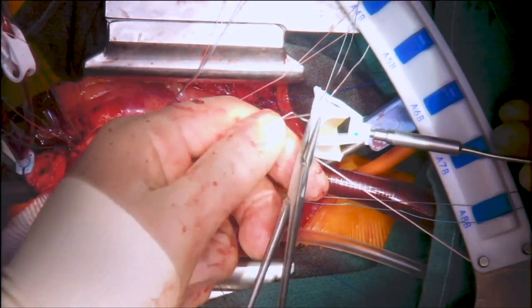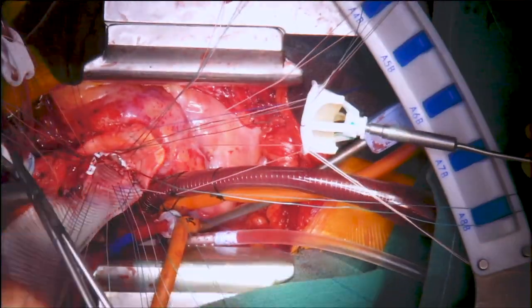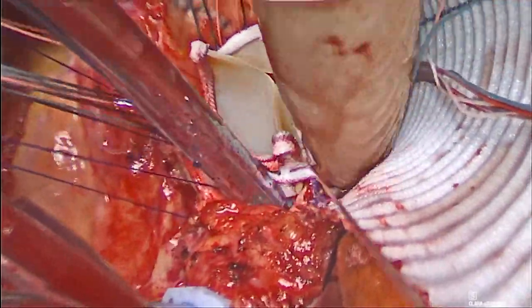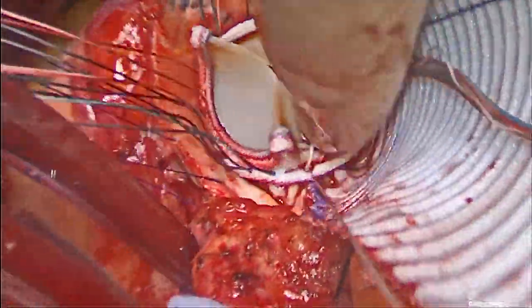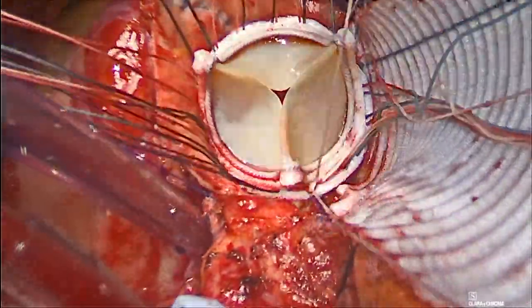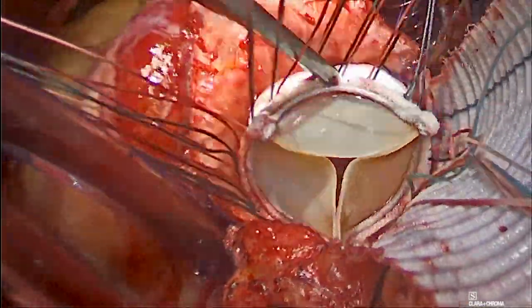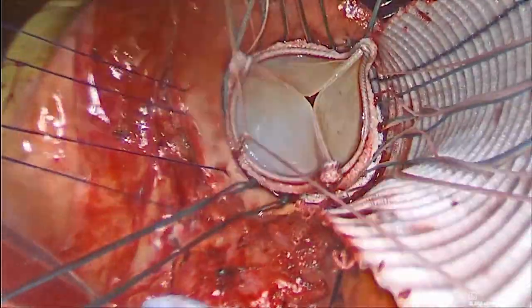All sutures were passed through the bioprosthetic aortic valve. The valve was slid down and tied in place. Careful attention is required to ensure that the valve is very well seated as it is tied down.